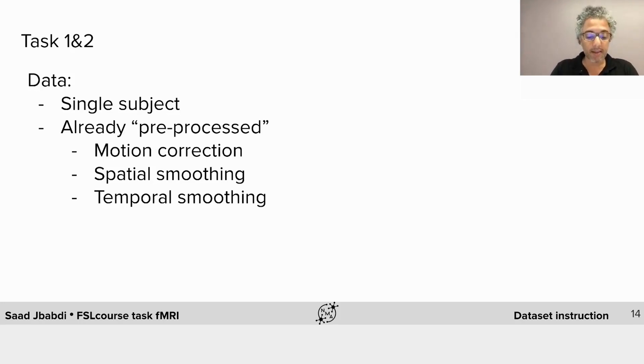Both datasets are whole brain but only from a single subject and not necessarily the same subject for the two tasks. They have already been run through standard fMRI preprocessing such as motion correction and spatial and temporal smoothing.